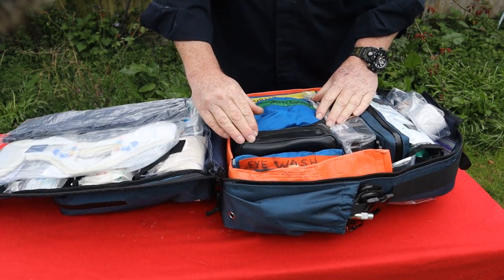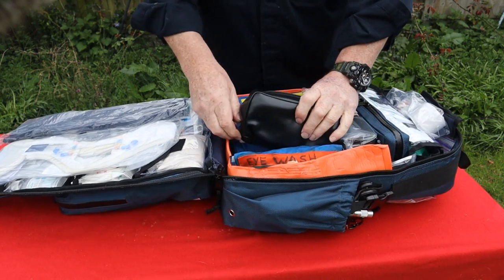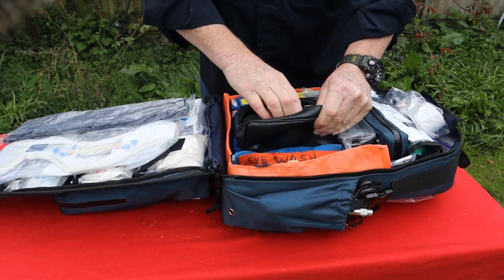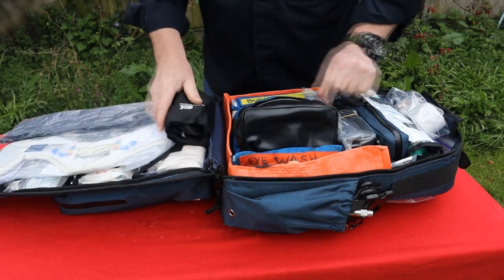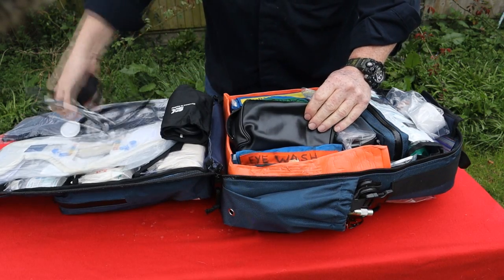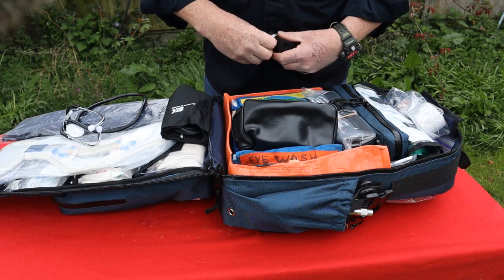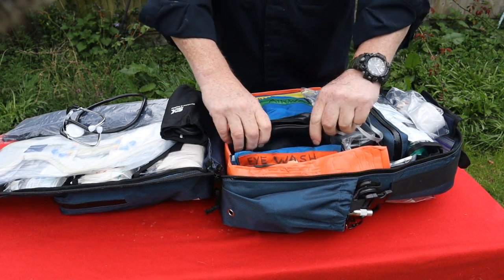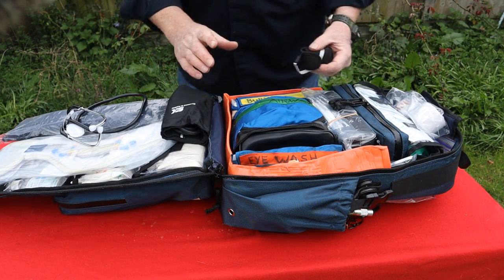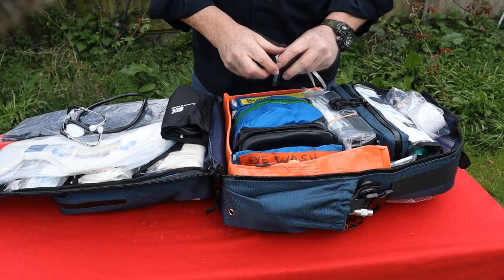Here I've got a BP cuff, stethoscope, and a pulse oximeter. Pulse oximeters nowadays are, you know, when I was a kid it would be kind of Star Trek, where the doctor would wave a little box over someone and it would tell them what's wrong. So again, basic stethoscope, so chest sounds, blood pressures, apexes and bases of the chest, just to evaluate someone's breathing. A normal respiration rate is between 16 and 24 breaths a minute. You will find people that disagree with that, but that's my kind of rule of thumb.